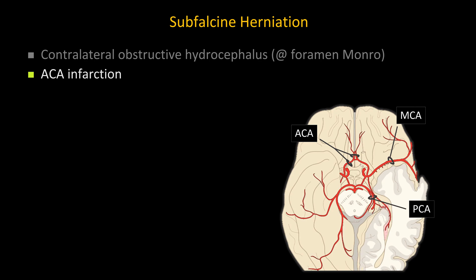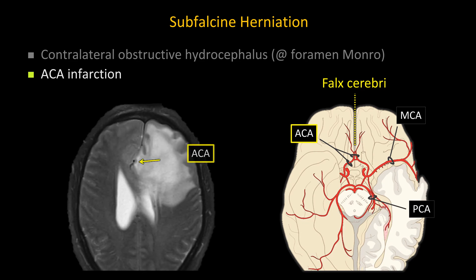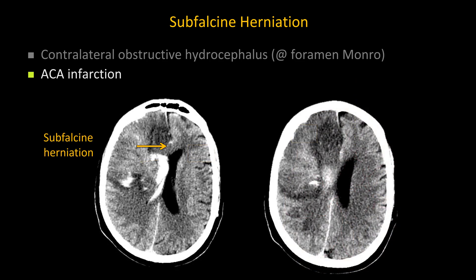Complications of subfalcine herniation include obstruction of the CSF outlet at the foramen of Monro — the passage between the lateral ventricle and the third ventricle. A large left-to-right midline shift typically causes obstruction at the foramen of Monro, resulting in contralateral dilatation of the lateral ventricle and ipsilateral compression. Another potential complication is ACA infarction: the ACA runs in close relationship to the falx cerebri, and a large subfalcine herniation can compress the ACA. This example shows a patient with right-to-left subfalcine herniation with resultant right-sided ACA territory infarction.